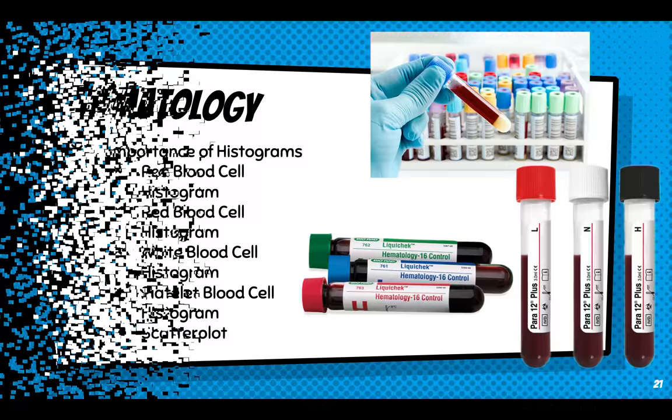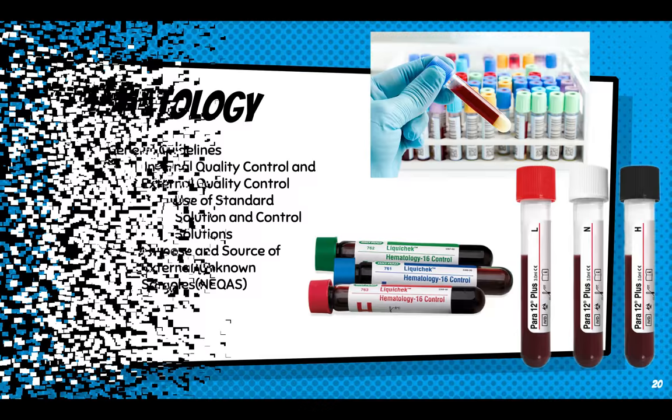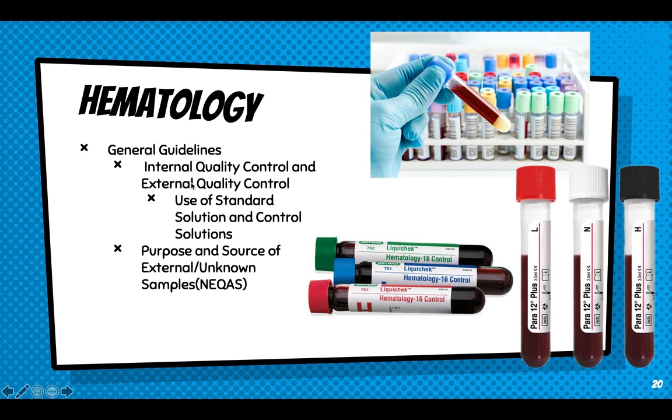So for hematology, similar to what was said a while back, I will not deal with too much of the internal quality control anymore, because it's the very same thing that we do in all other sections. But before I move on, I just remembered that when it comes to external quality control, it is coming from the National Kidney Transplant Institute. Usually we have your unknowns being sent to the laboratory, and similar to how you do it in clinical chemistry, you run it in the same manner that you run your samples each and every day. You'll be having at least 3 unknown whole blood samples, and you will run them in your hema analyzer the same manner that you run your QC and your samples.